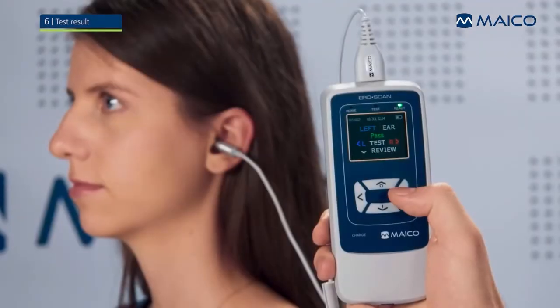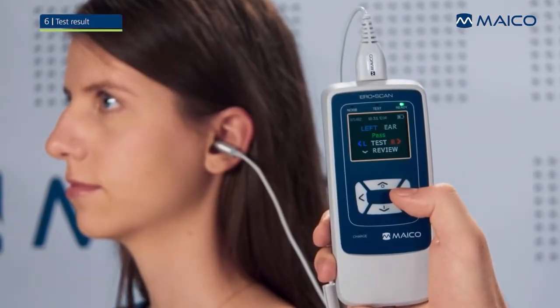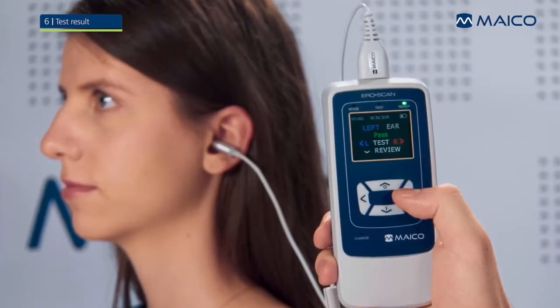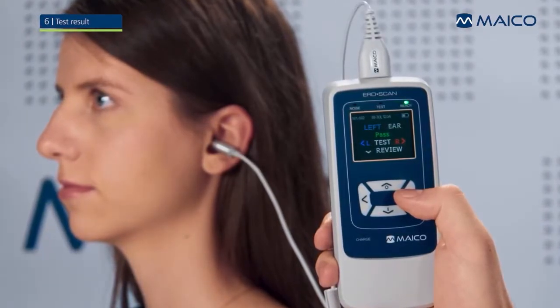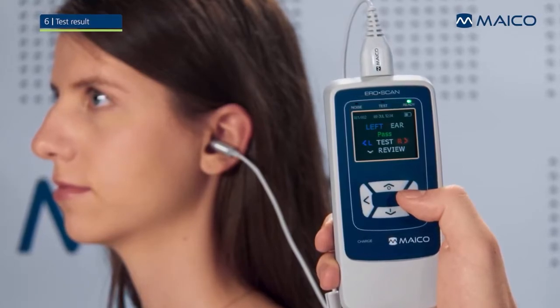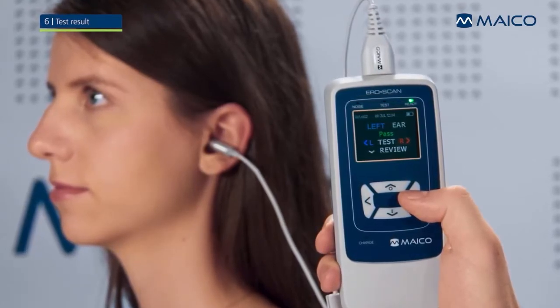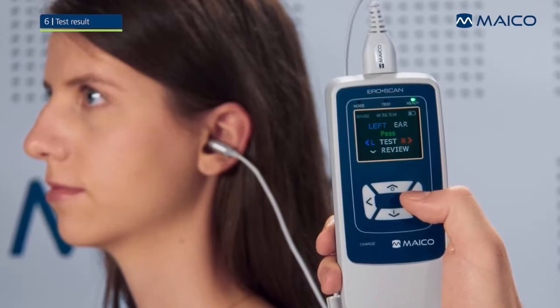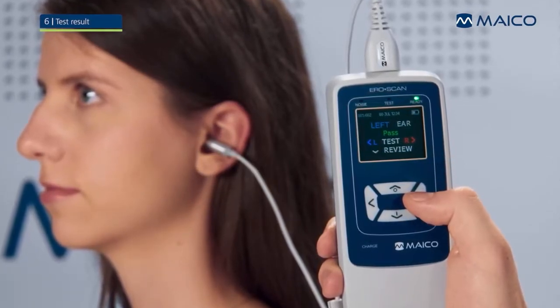A green pass indicates that the passing criteria for the selected screening protocol are fulfilled. An orange refer means that rescreening or further diagnostic measurements are necessary. If the result shows a message other than pass or refer, improve test conditions and repeat the measurement.